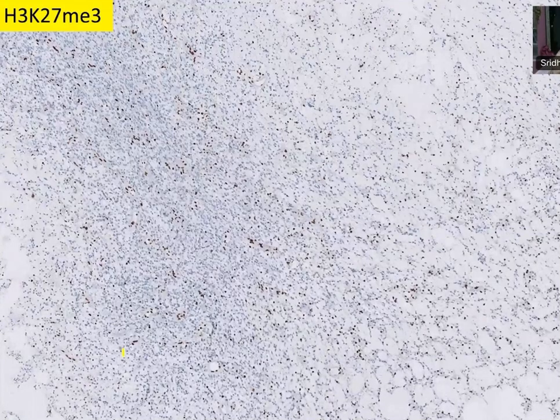H3K27Me3 is a marker, a trimethylated protein. In mutated tumors, there will be loss of the trimethylated protein. Here it is again a normal protein, and you are supposed to interpret whether it is present in the tumor or not. How is this pattern similar to ATRX or P53? Like ATRX staining, that means there is a loss of H3K27Me3, right?